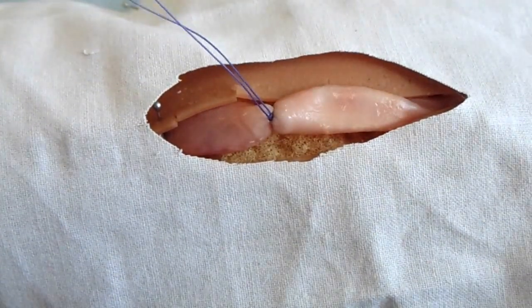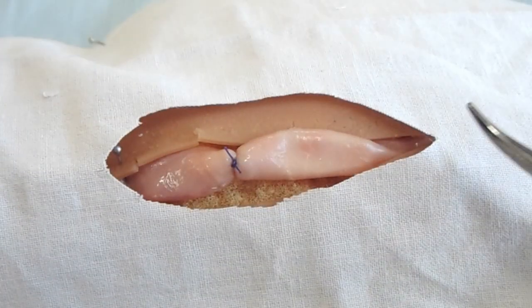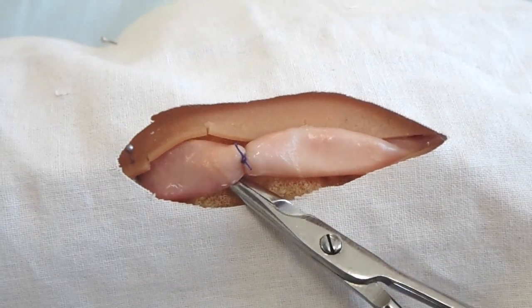The ends of the filaments are cut. Approximately one centimeter away, a simple ligation is done.